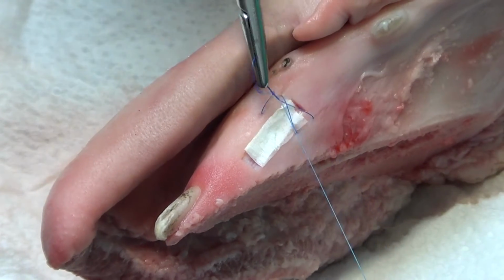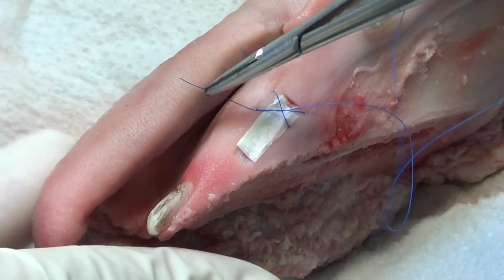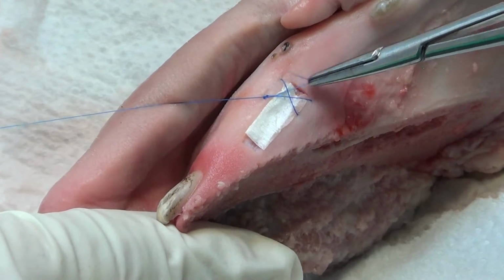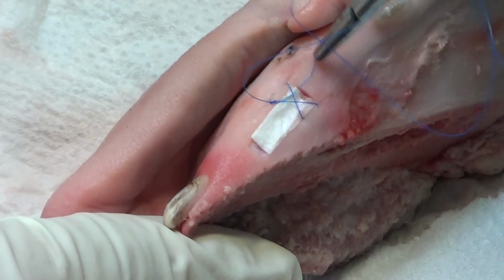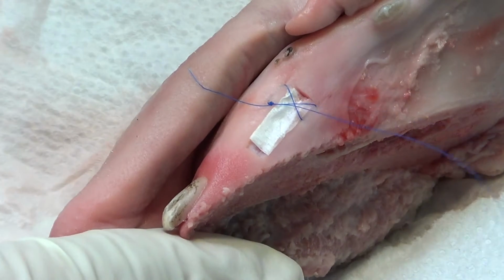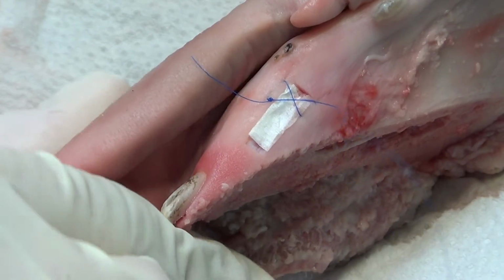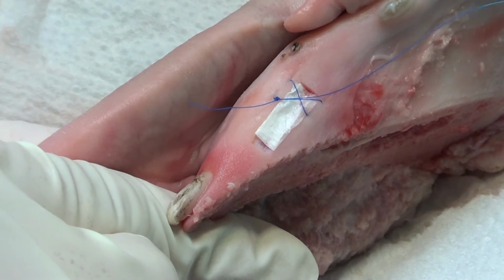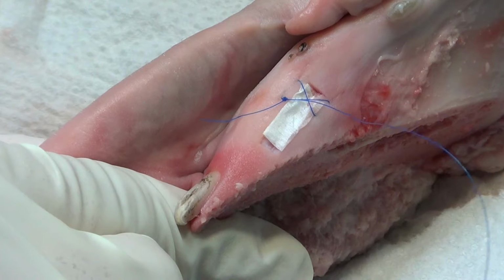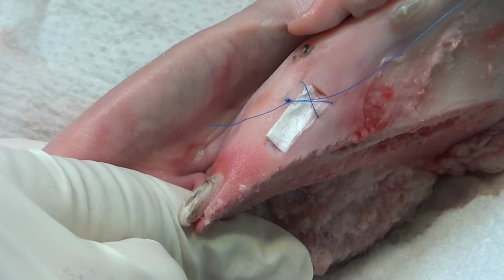So, 2, 1, 2. Okay, you can do 3 of them, or if you have a little bit shorter wound, 2 of them, and you block the sponge. So from this point you can go vestibulary to do the vestibuloplasty.